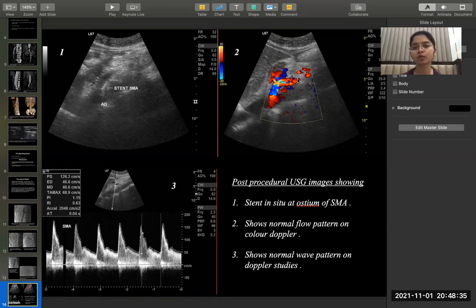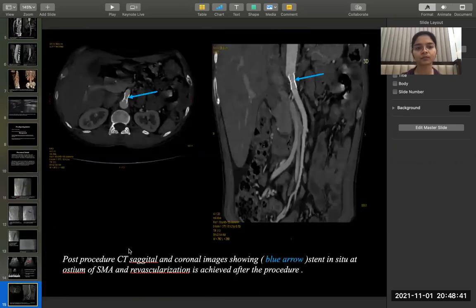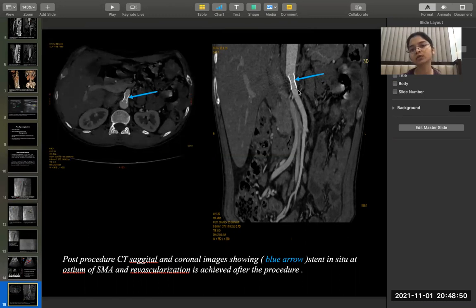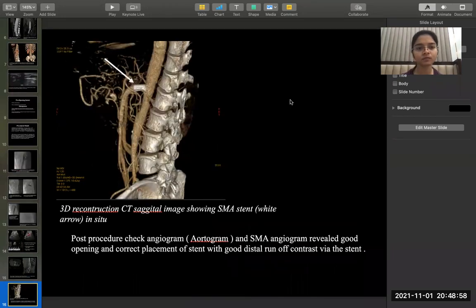Colour flow Doppler shows normal flow at the site of occlusion post-procedure and also shows a normal waveform. Axial and coronal CT post-procedure shows the stent at the site of occlusion of the SMA, along with free flow of contrast post-procedure, indicative of normal flow in the SMA. Post-procedural 3D reconstruction image shows the stent in situ at the site of SMA occlusion.